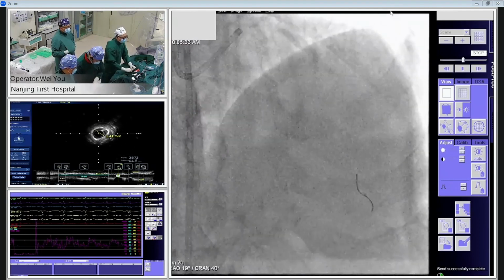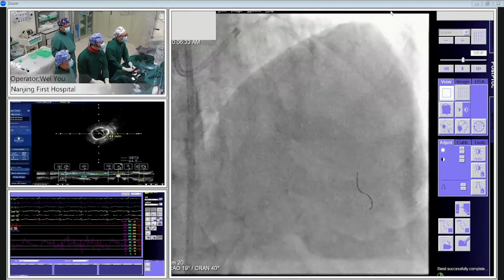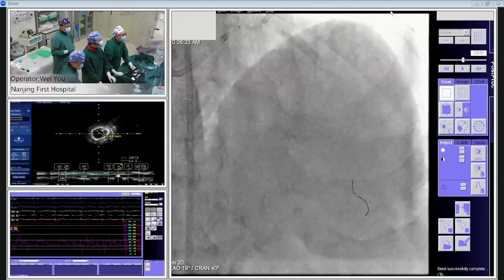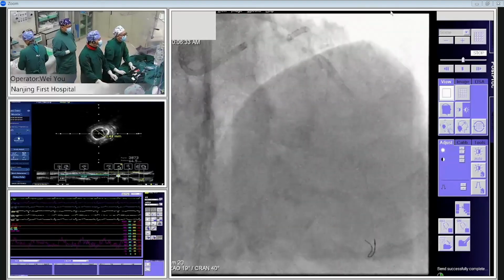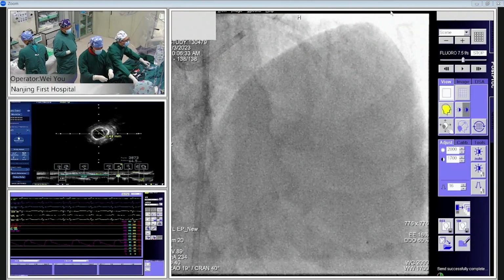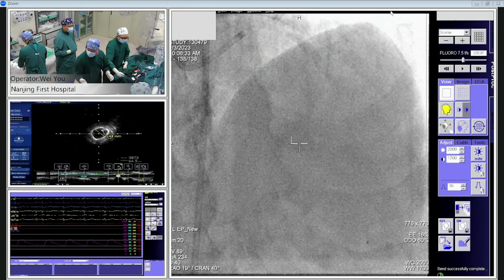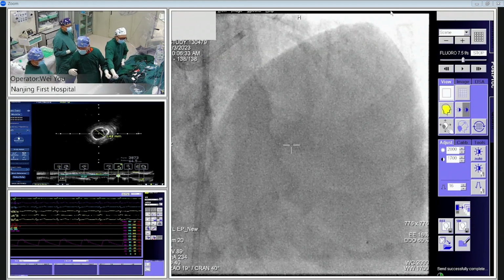Till now, the patient's hemodynamics are stable, no symptoms. Very good. Considering it's an elderly patient, an 80-year-old gentleman, and also the eGFR is only 60. Yeah, so I think it's CKD stage 2 to 3. So we should save the contrast medium. Extra support. So this is why we choose IVUS-guided, not OCT-guided. Yeah, that's a very important point.